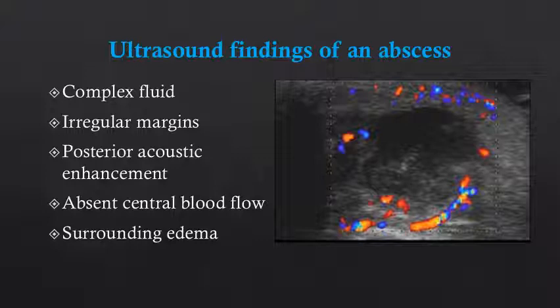Now let's shift gears and start to look at the ultrasound findings of an abscess. An abscess is a complex fluid collection. It tends to have irregular or poorly defined margins. You often will see posterior acoustic enhancement behind an abscess because an abscess is fluid filled. There should not be central blood flow within an abscess — masses tend to have central blood flow, which can help differentiate the two. Another characteristic of an abscess is surrounding soft tissue edema, caused by substantial inflammation of the surrounding tissues from the presence of infection.